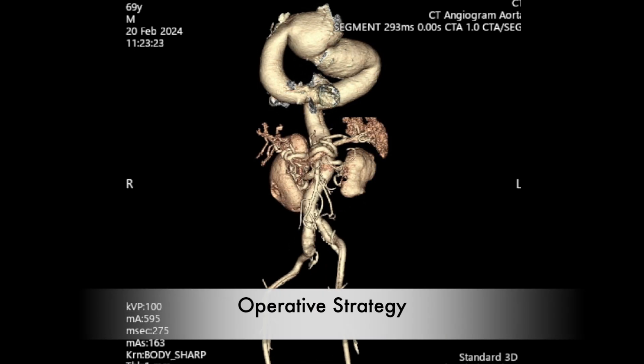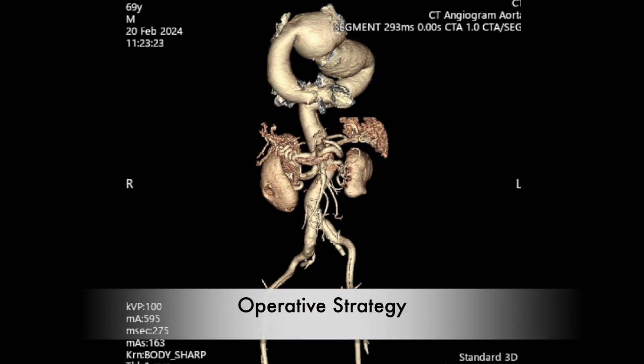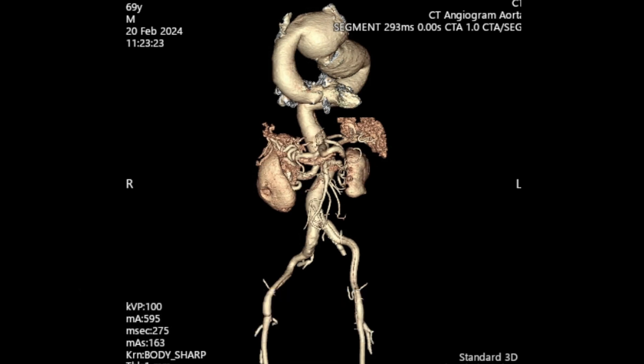How do we repair this? The first step is to establish an extra-anatomical bypass. Our vascular surgeon, Dr. Rathik Vosabian, is going to perform a carotid-subclavian bypass and ligate the base of the left common carotid artery.